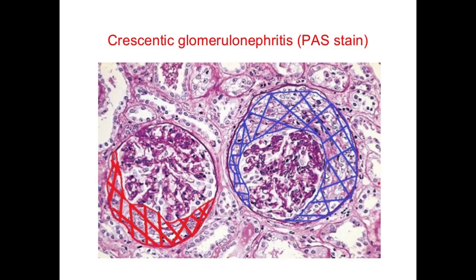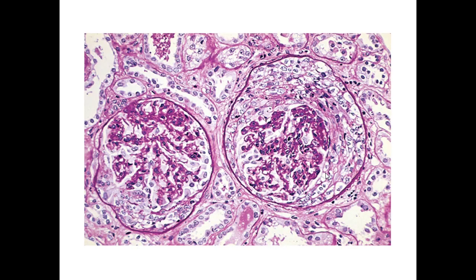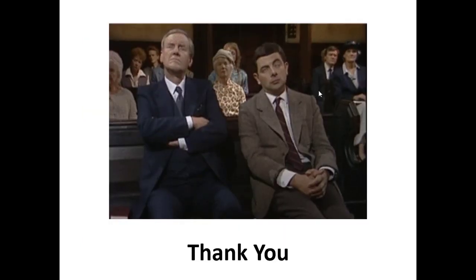The patient will be anuric, with no filtration at all, and we will find the patient's kidney function deteriorated within a very short time. This is why the patient deteriorates, because as you see here, there is no urinary space at all. This one epithelial layer of the Bowman's capsule replicated to 10 or maybe more rows will occlude the urinary space.